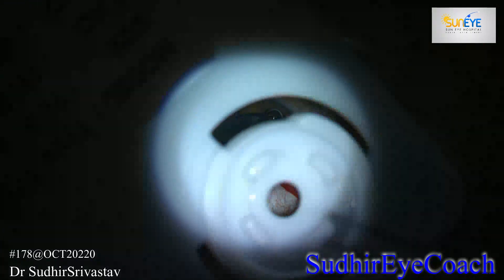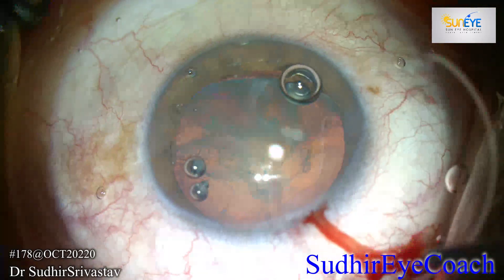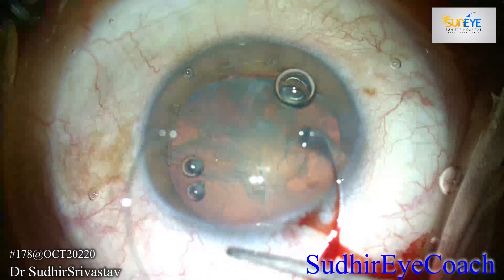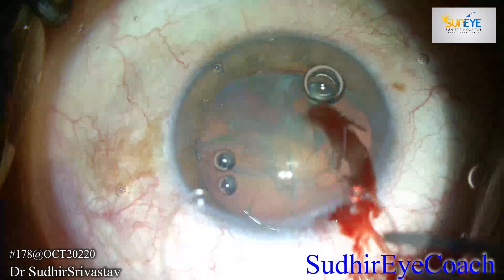Very gently I performed hydro procedures — hydrodelineation and hydrodissection — then filled the chamber tightly with viscoelastics. Now I am ready to implant the endocapsular ring. Always assess the right size of the endocapsular ring.